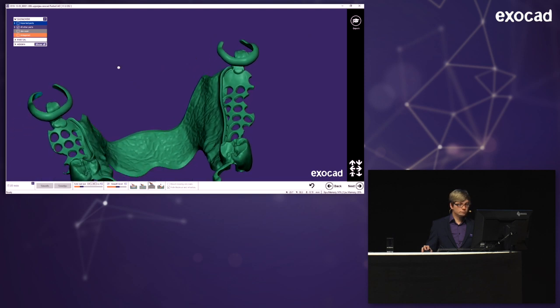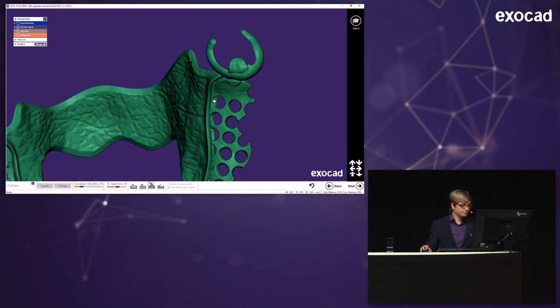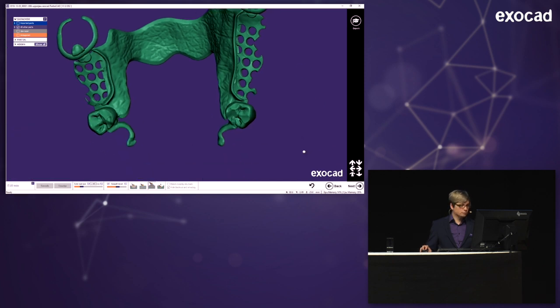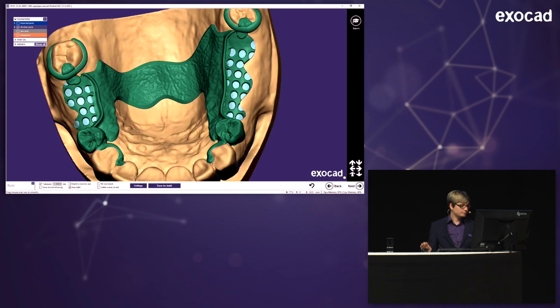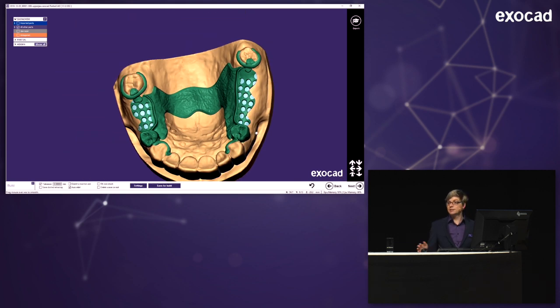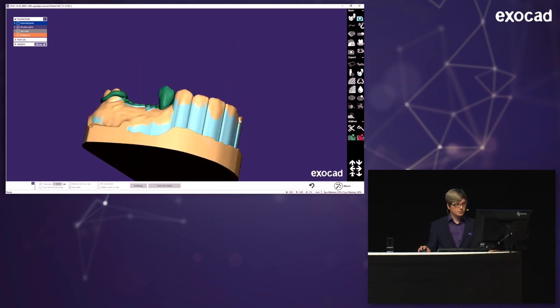So I think I'm happy for now. This is kind of a finished partial for now. I'm going to the next step. And now I could actually save it for build, which is kind of the same as merging all the parts. But I can now also switch to the expert mode again and use all those different functionalities I have. And there are really nice ones.